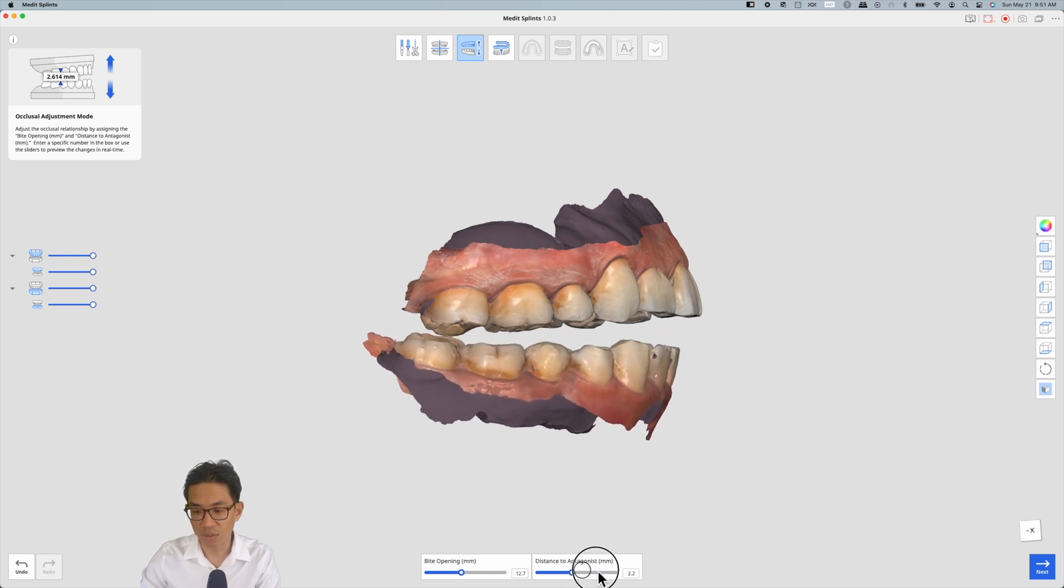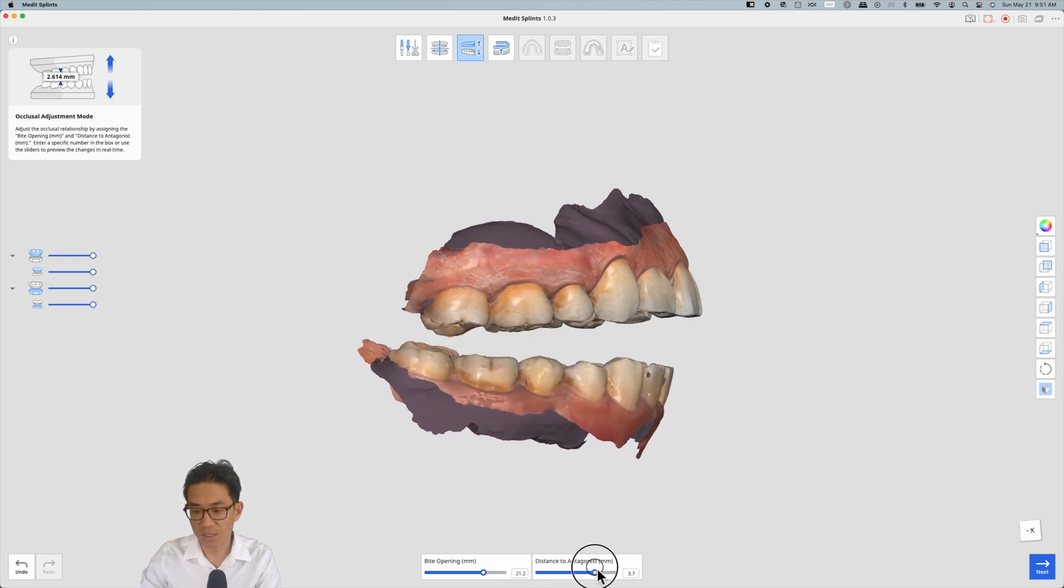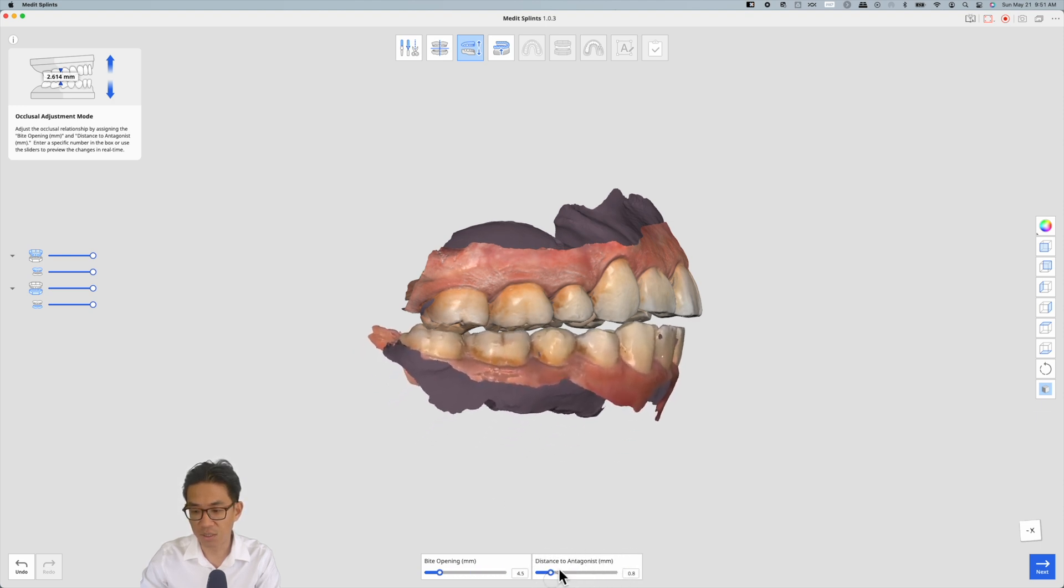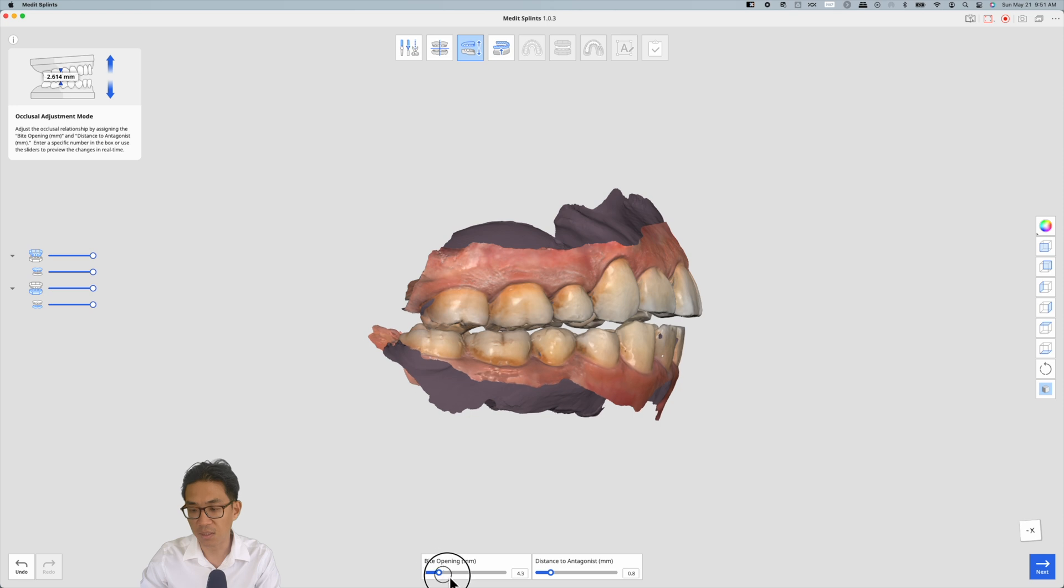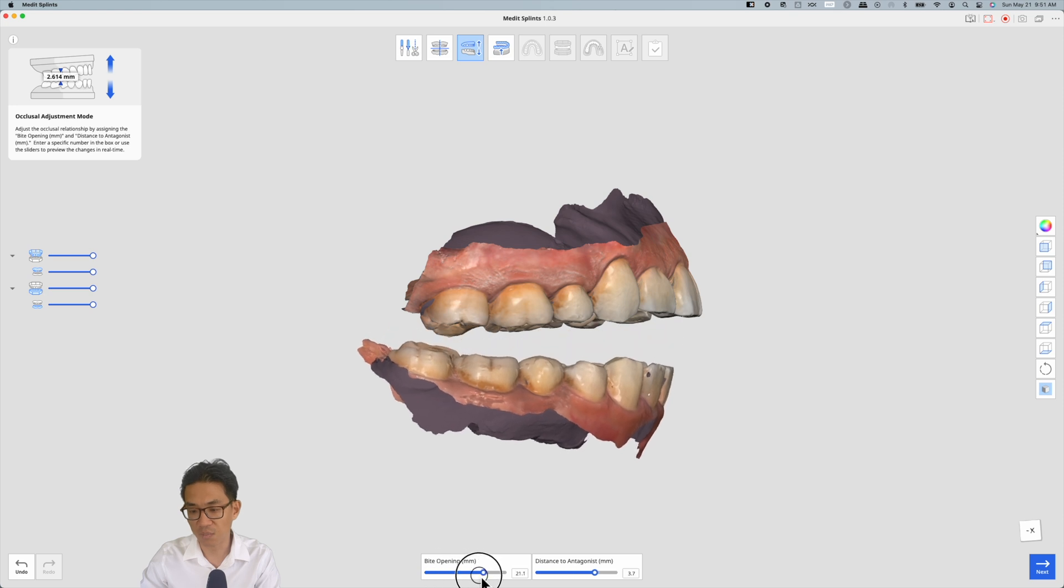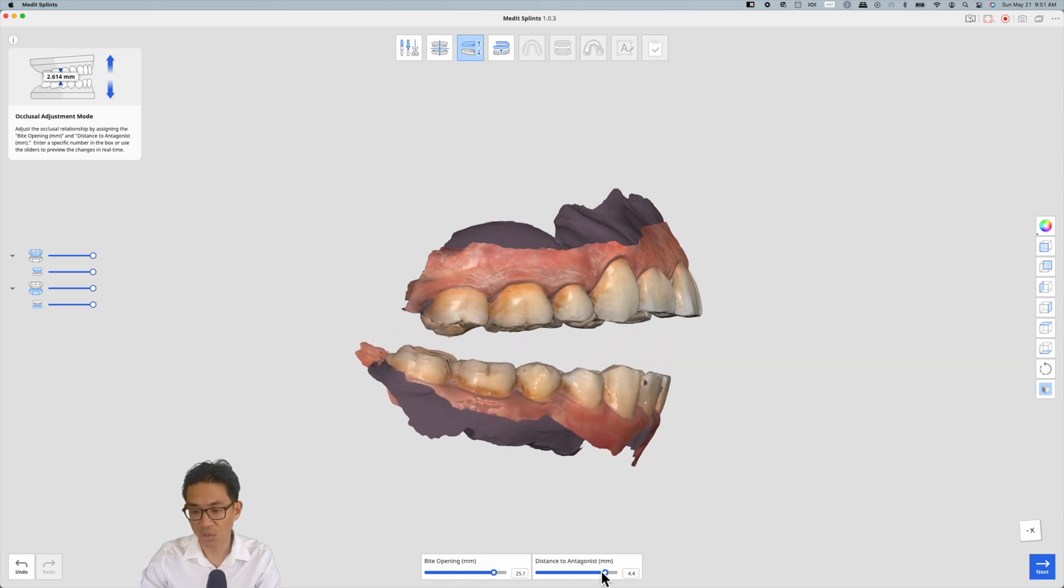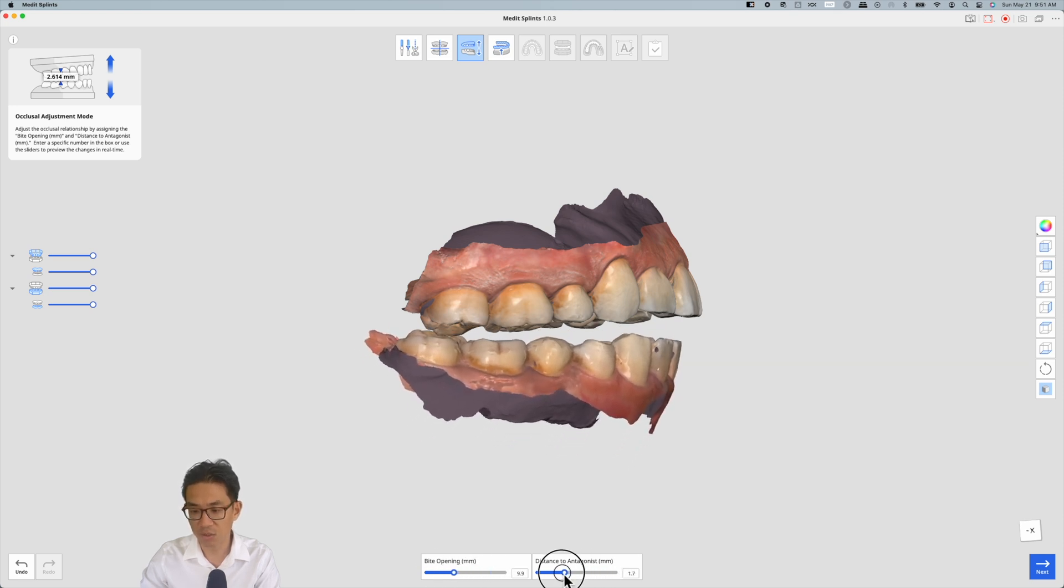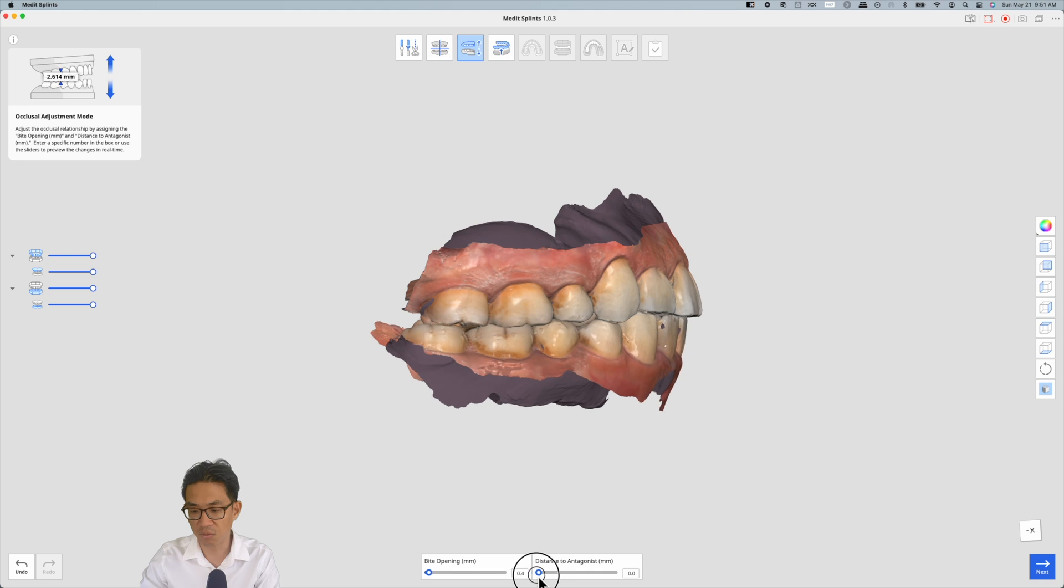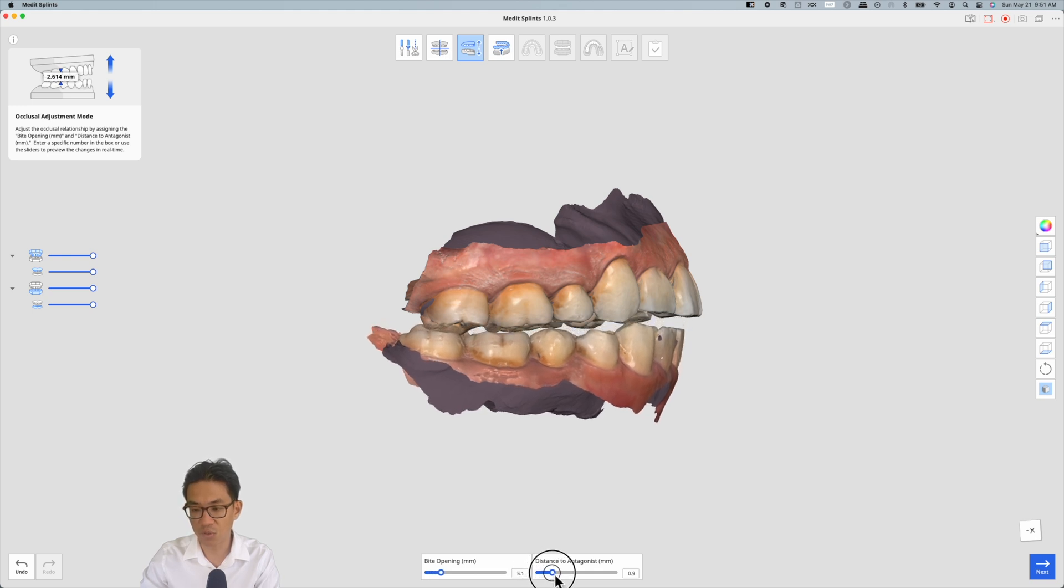As I'm changing the distance of the antagonist, this is between the posterior teeth, the bite opening in the anterior goes up almost five times as much. So there's a ratio there. We like to set it to 1.1mm.